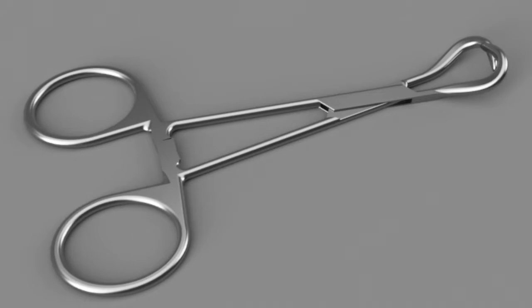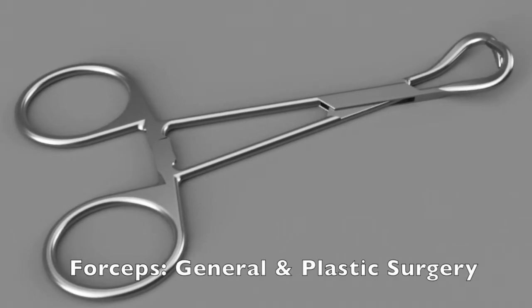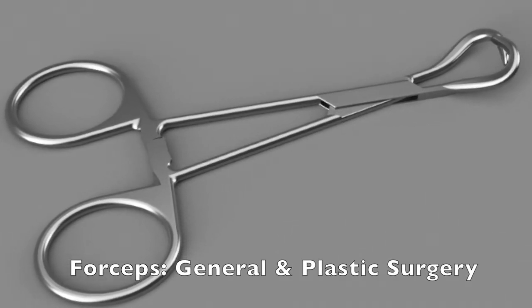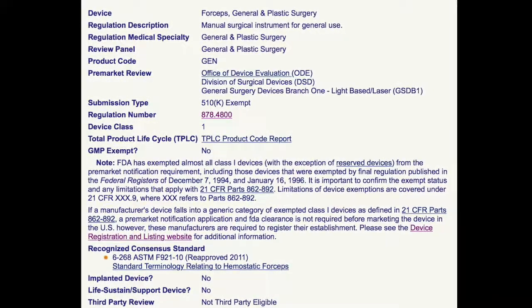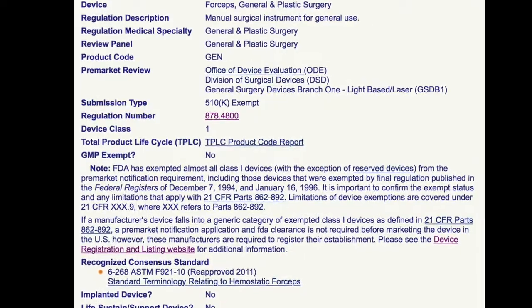Backhouse towel forceps are classified by the FDA as forceps for general and plastic surgery and are listed as a Class 1 device. This means this instrument is considered to have a low level of risk compared to other medical devices.